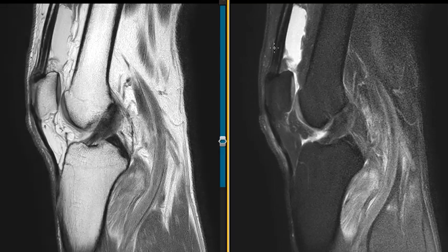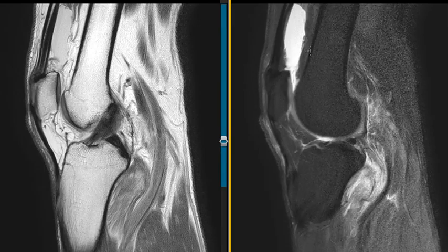The patient has a big joint effusion above the kneecap. This is the suprapatellar pouch above the kneecap. You can't really see it very well in this view because the fat and fluid are the same signal, and it just doesn't stand out. But on this view, where they're a different signal, really obvious large joint effusion.